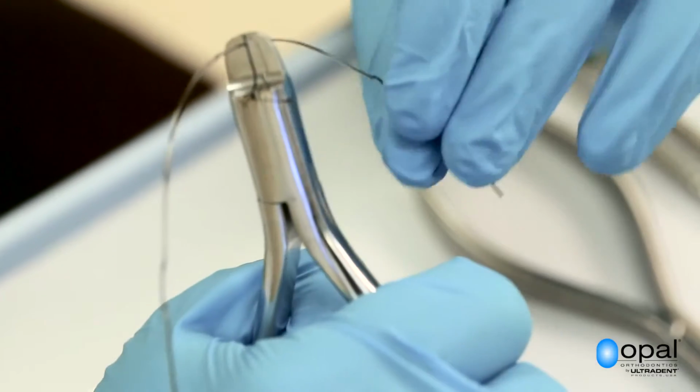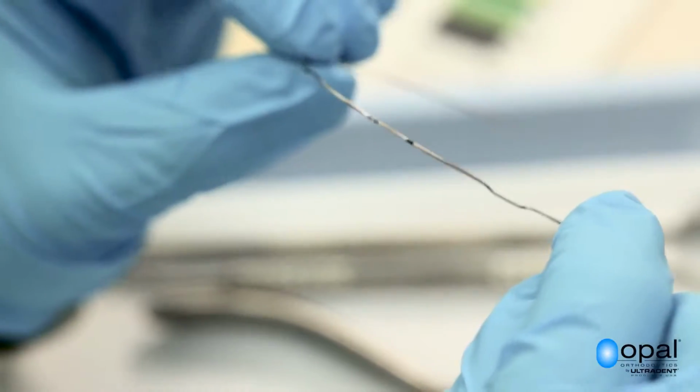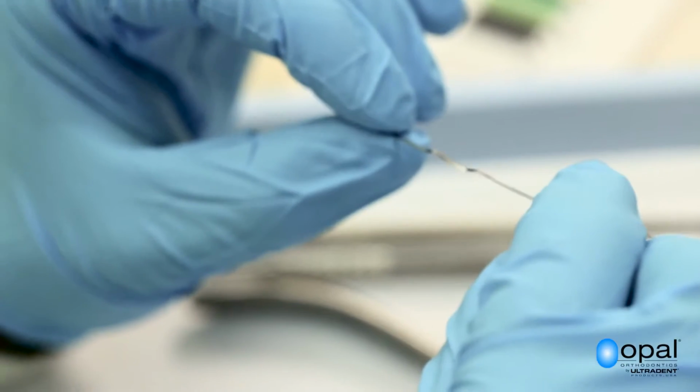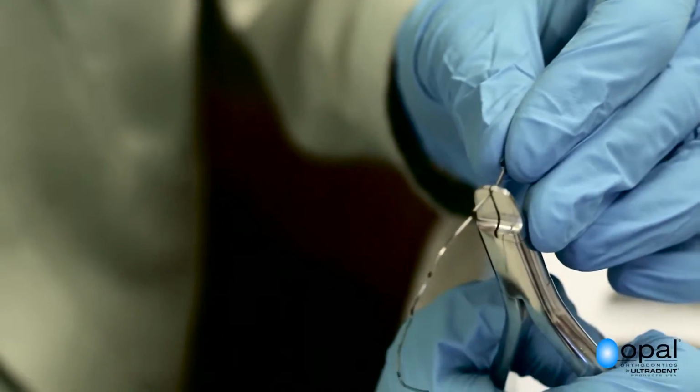With other bracket systems that I used, I routinely was making step bends or rotation bends or a ton of torque bends or third order bends to be able to get my case to what we call a board standard finish. In the majority of orthodontic offices, the only person that can place those bends is the orthodontist. There's only so many bends that can be placed in that wire before that wire breaks.